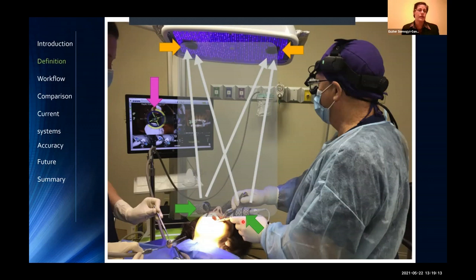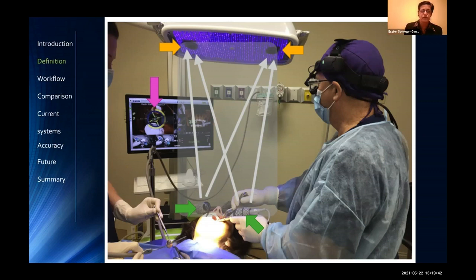And then, of course, there is the navigation portion where you can see this marker moving according to how the implant is placed. And you can also see that the drill actually moves on the patient's CBCT. So if there's any kind of anatomical structure, or if there is not enough bone, then it can be very useful to see exactly where that drill is in the bone on the CBCT instead of just approximating it in the patient.